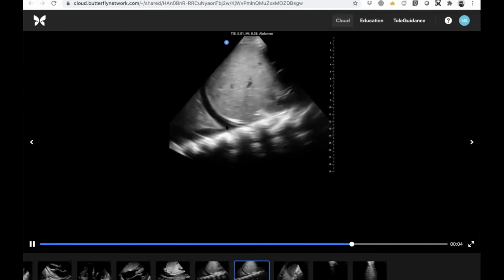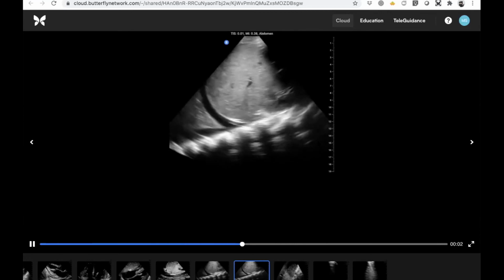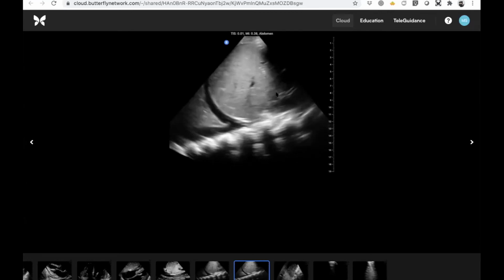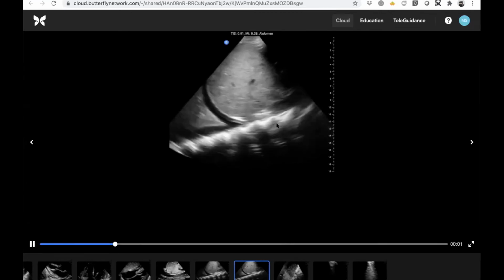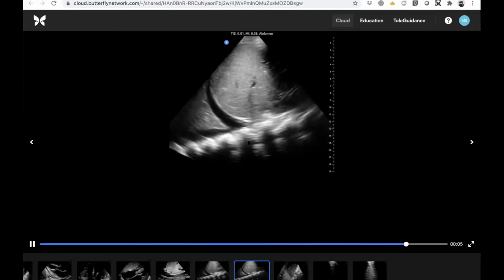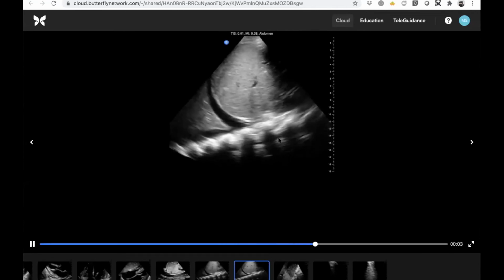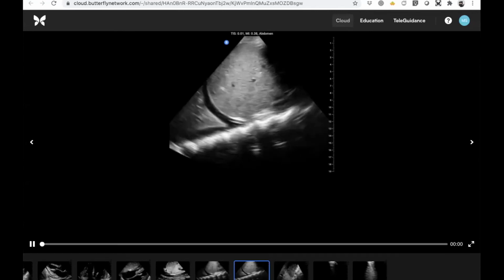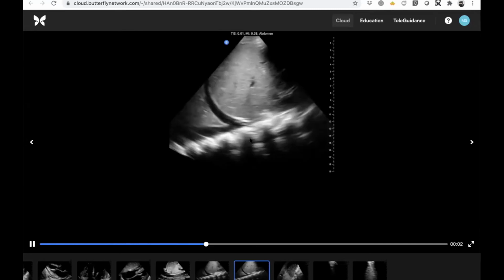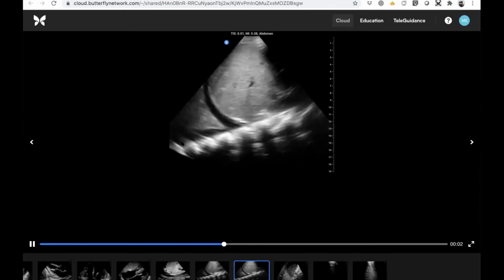Yeah, absolutely. And could we have a little bit less depth? Maybe. If we're going to nitpick technique, I think you could fill the screen a little bit more with what we're looking at, but it's a great image. It's diagnostic. I mean, this is a patient with likely protein calorie malnutrition, just given the background of the clinical history. And you can see the spinal canal deep to the vertebral bodies. I mean, you can kind of see all the anatomy with ultrasound here.